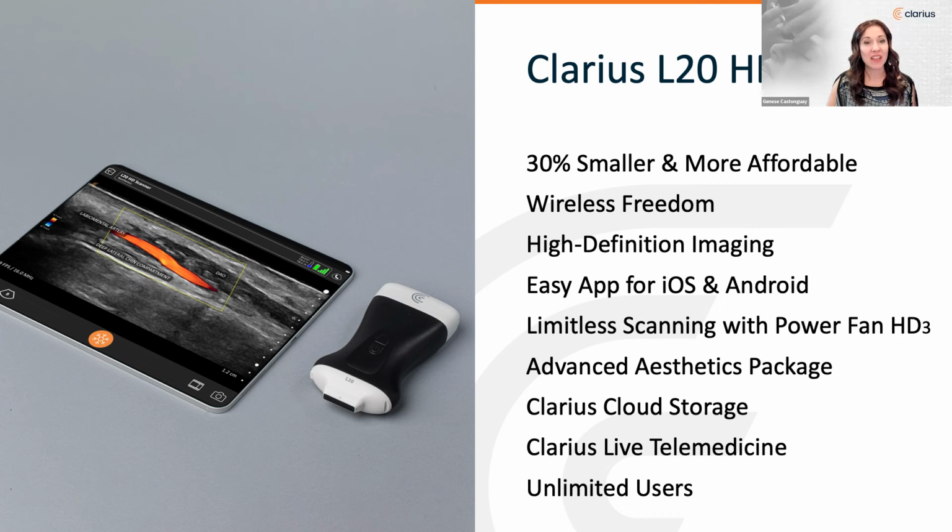I'd like to share a piece from a position statement on dermatology ultrasound by the European Federation of Societies for Ultrasound in Medicine and Biology. The statement is: a minimum transducer frequency of 15 megahertz should be used for dermatologic ultrasound. This means Clarius is actually the world's only handheld ultrasound to meet and exceed this published guideline and recommendation for facial aesthetics and dermatology.